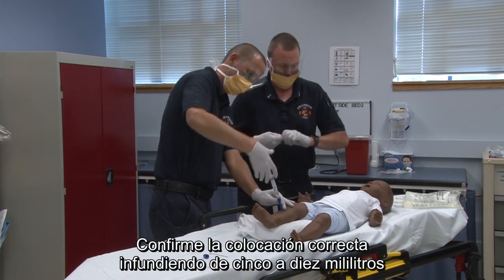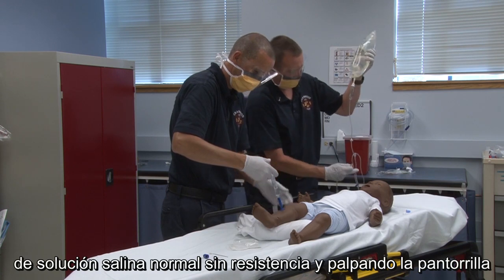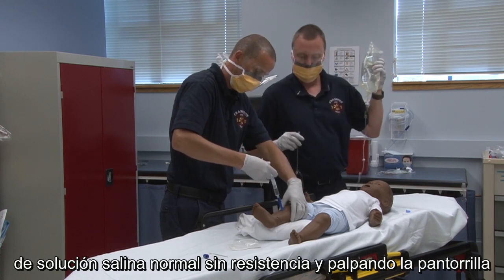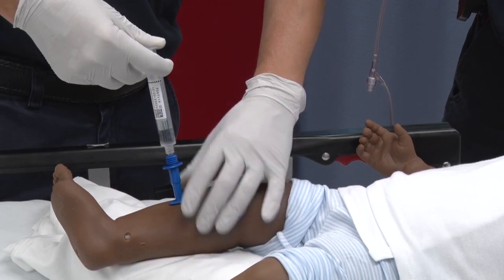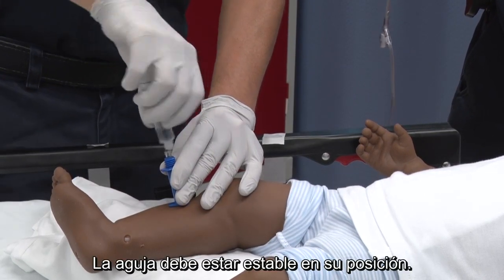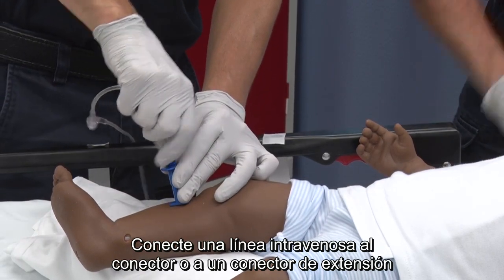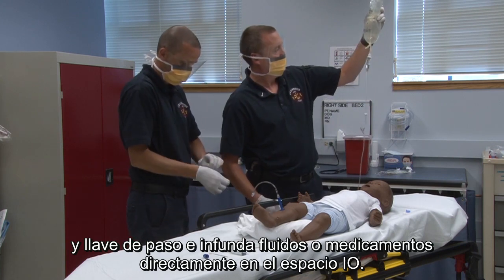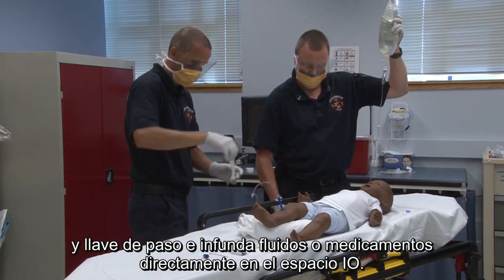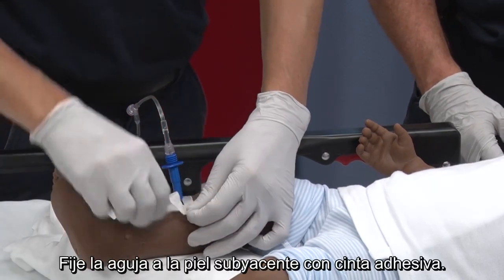Confirm correct placement by infusing 5 to 10 milliliters of normal saline without resistance and feeling the calf to assure it is not becoming swollen. The needle should be stable in position. Attach an IV line to the hub or to an extension connector and stopcock, and infuse fluids or drugs directly into IO space. Secure the needle to the overlying skin with tape.